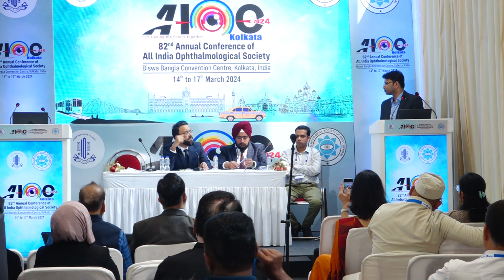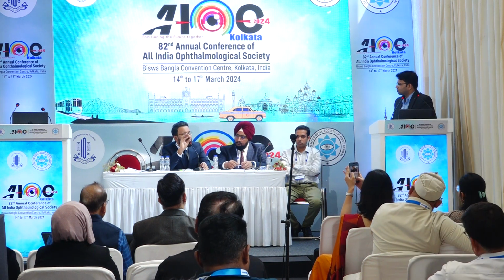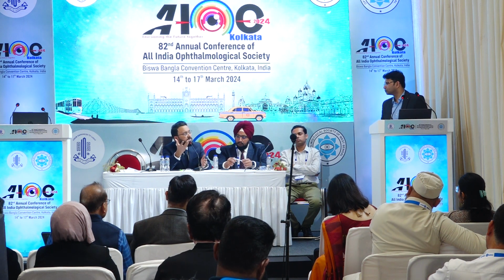Thank you. Fantastic presentation, Dr. Devesh. I just would like to add one thing, coming to the encircling band. My usual practice is I go for an encircling band in whatever doubtful cases I feel, even if there is no obvious detachment on the ultrasound. But if the ultrasound looks pretty bad, where there are a lot of vitreous adhesions and tractions, my entire rationale behind this is you may have a large break, probably an inferior break, which has not yet caused an RD, but after the PPV, even after putting oil, just as you showed in the case, you may end up having a redetachment, so it's always better to have a support.